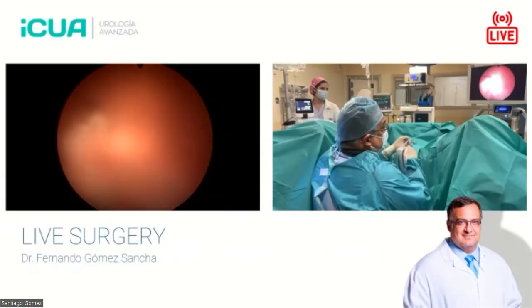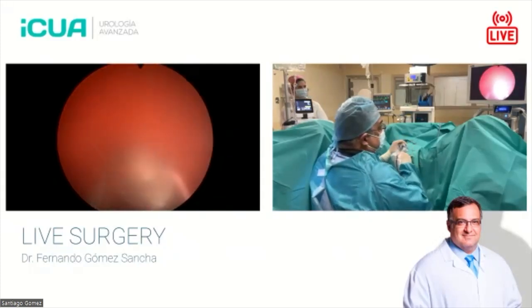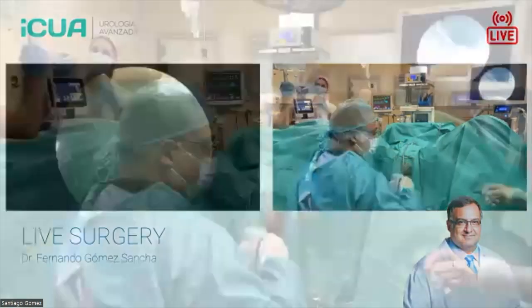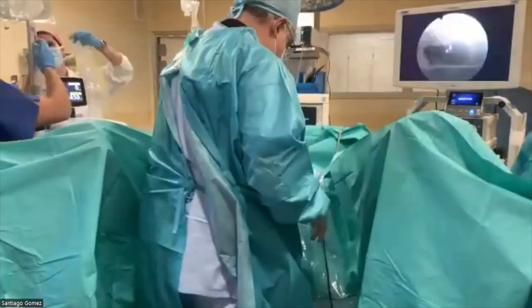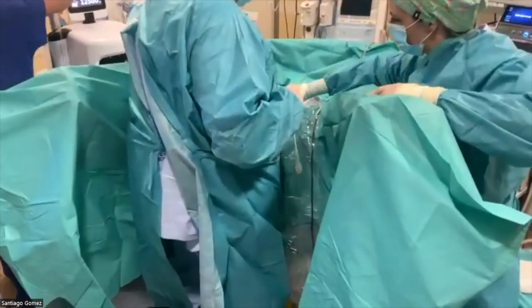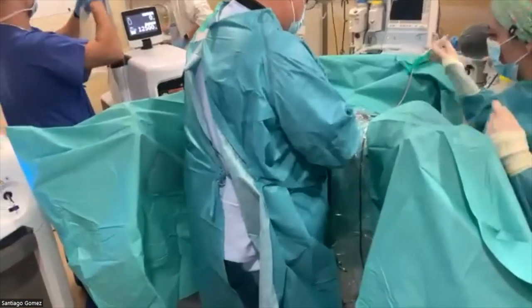So this is the end for me. I don't check again. What happens is that during morcellation, the irrigation power is not so good. So at the end, when we finish morcellation, there's always a little bit of blood in the fossa. But if we were able to morcellate properly, usually I don't go back to check again.